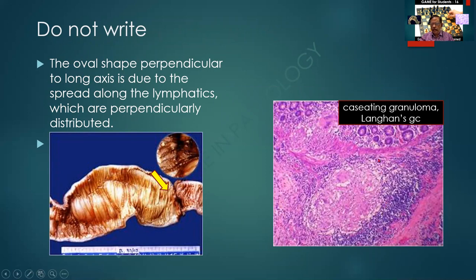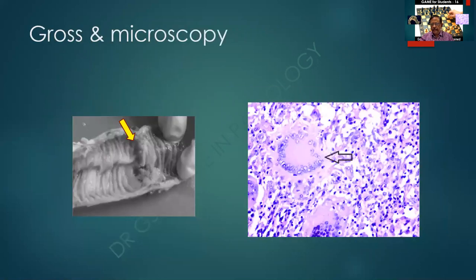I am able to see the intestinal mucosa, then a granuloma with caseating necrosis and giant cells, surrounded by lymphocytes. All the dark blue dots are the lymphocytes. So, a very beautiful photomicrograph retrieved from the net. I am able to find a constricting ulcerative lesion surrounded by normal mucosa. In this, there are a couple of giant cells, one of which has a typical horseshoe distribution of the nuclei. This is an example of a tuberculous lesion.